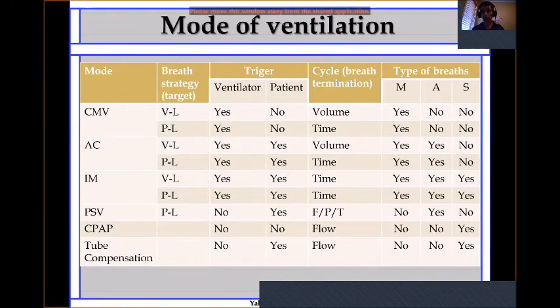But if you feel that the patient will get tired, then you need to take control and use assisted control. But when you want the patient to take some part of it, you go with SIMV. But remember, because the patient is driving the machine, they will get tired and exhausted with time.